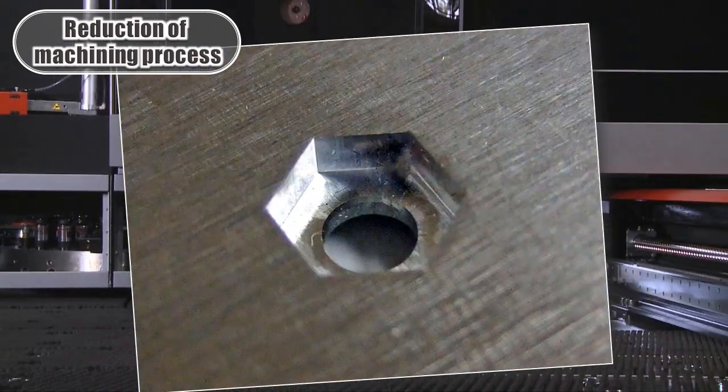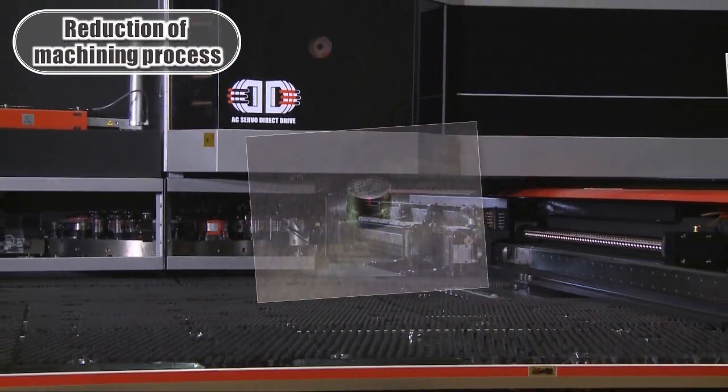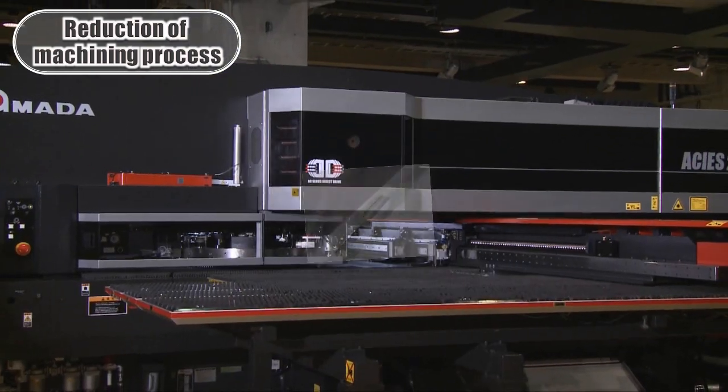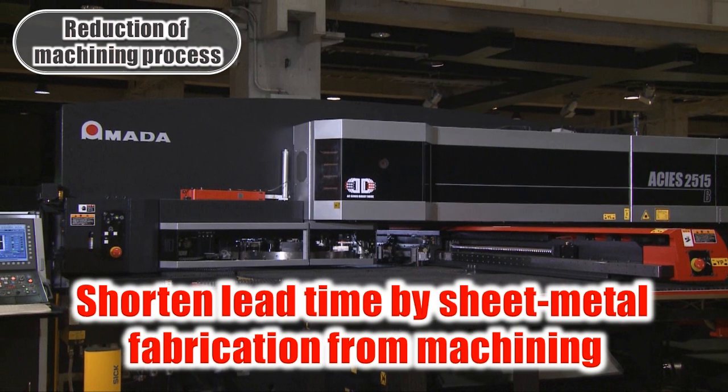By incorporating all these processes into the blanking process and eliminating the machining process, the lead time can be reduced significantly.